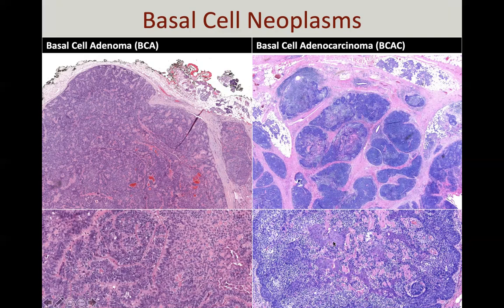So one thing I'll mention now, since it's here, is that squamous metaplasia is one of those features that can be present in pretty much any salivary gland neoplasm. So you can always think about squamous metaplasia, mucinous metaplasia, sometimes even sebaceous metaplasia that can occur in salivary gland neoplasms. That doesn't mean that that is necessarily a diagnostic feature of that tumor. So you have to take into account how diffuse are those areas? Do they fit in the context of what you're expecting for the remainder of the tumor? But remember that metaplastic changes can happen in many, many neoplasms.